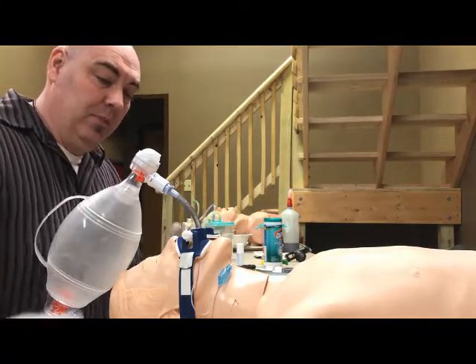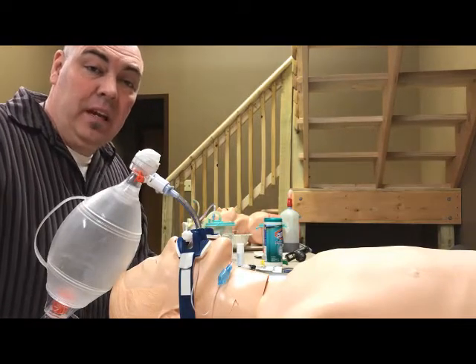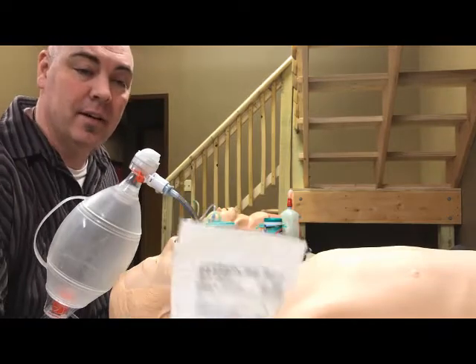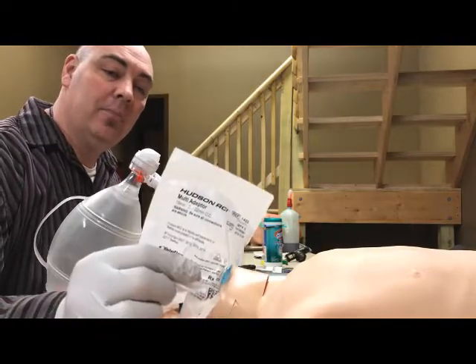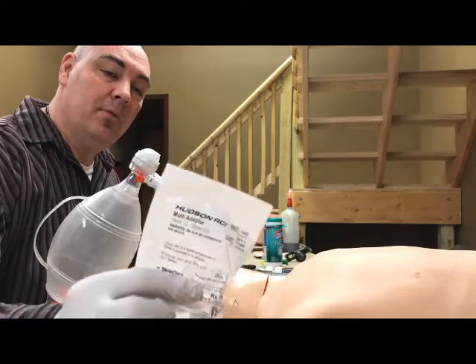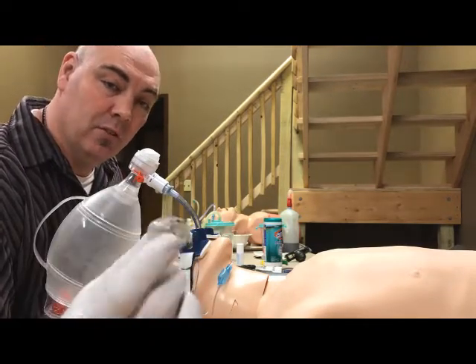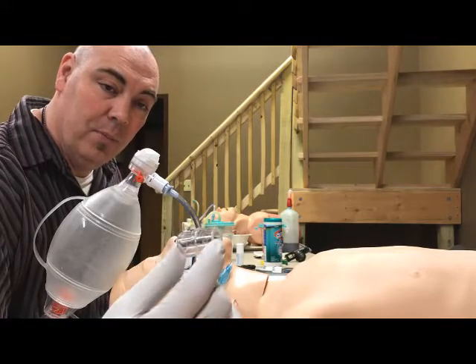In the past, we haven't been able to do this without significant jury rigging to put it in line. What we have now comes in a white plastic bag and will be found with the nebulizers. It is the 15 millimeter to 22 millimeter adapter. It doesn't look like much, but it will help a lot.